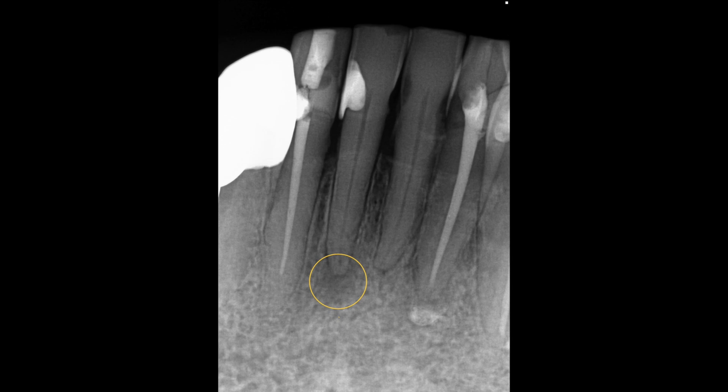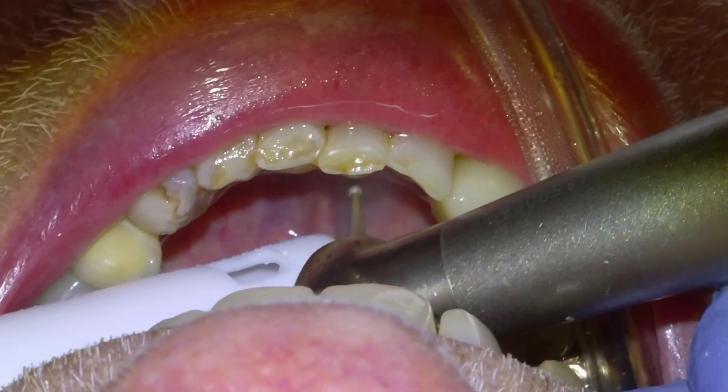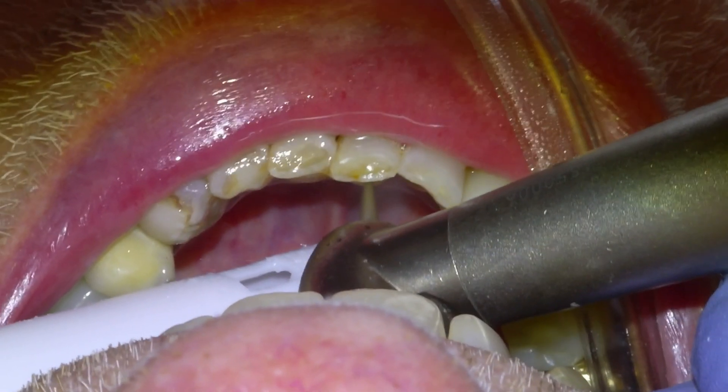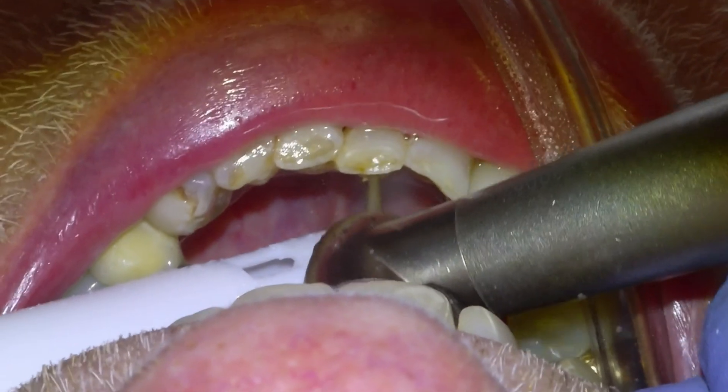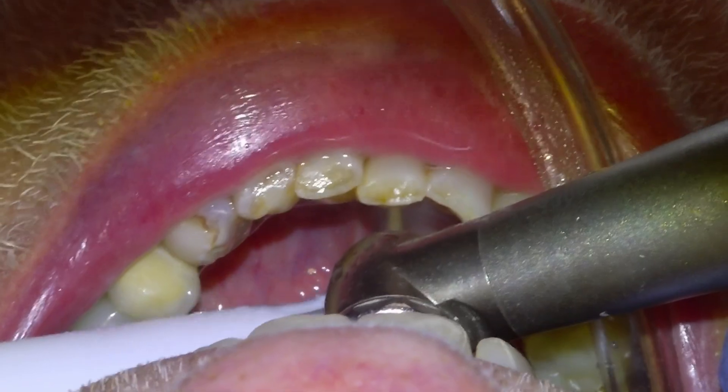Hi guys, Dr. Dobson going to be doing a 4-1 endo in this video. We're going to get started by anesthetizing with 1-in-200 articaine infiltration and then we'll begin accessing the pulp chamber with a small round diamond from the lingual side, and you can see a little bit of mobility from the apical bone loss.